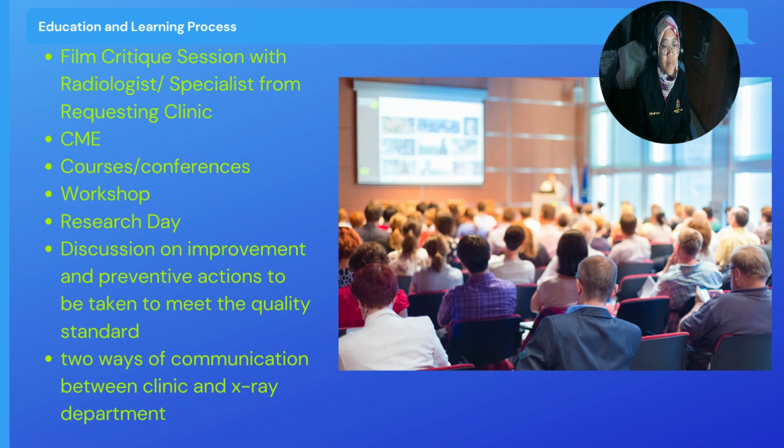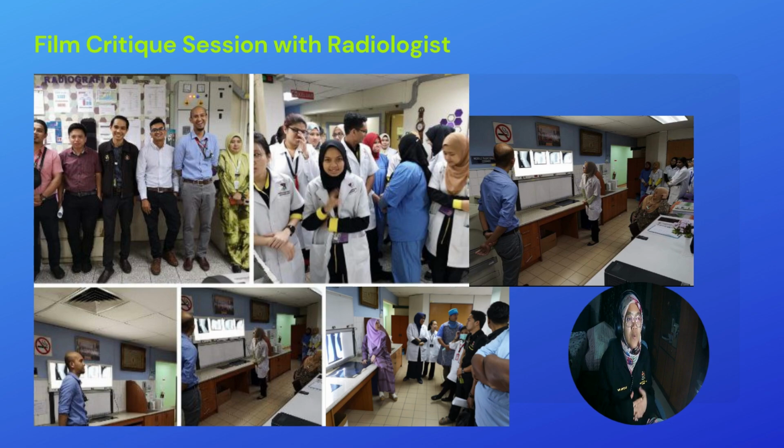In this part, I will share the experience from HKL. This is an example of a film critic session with radiologists. The film being rejected is brought to this area, and the radiographer is called to critique what is the reason the film was rejected.